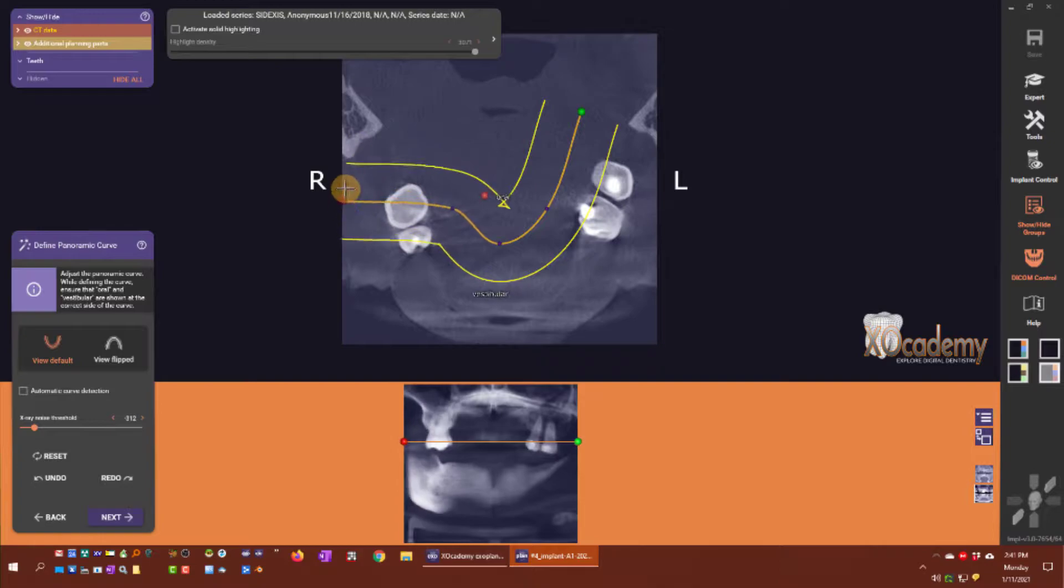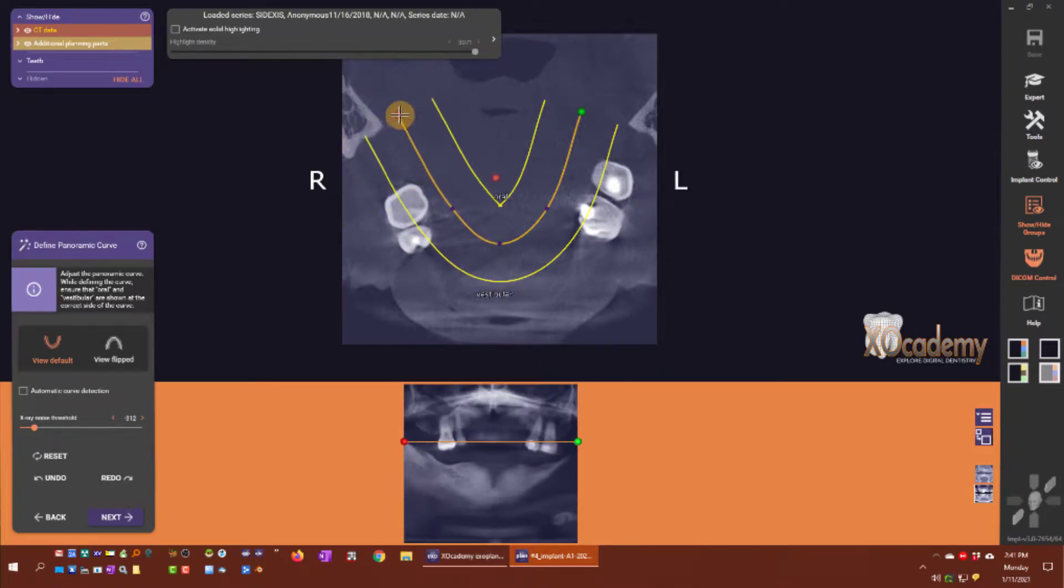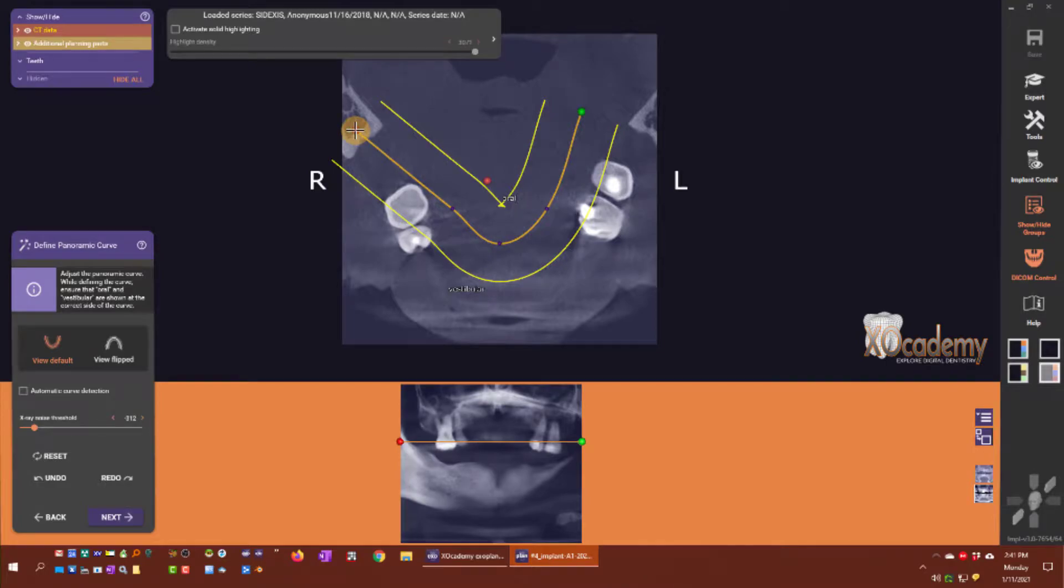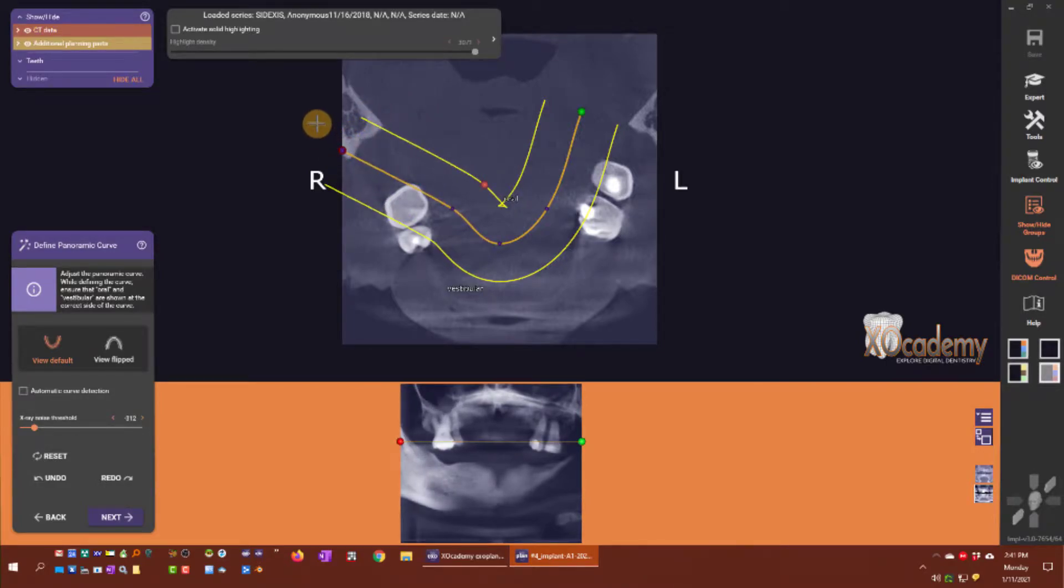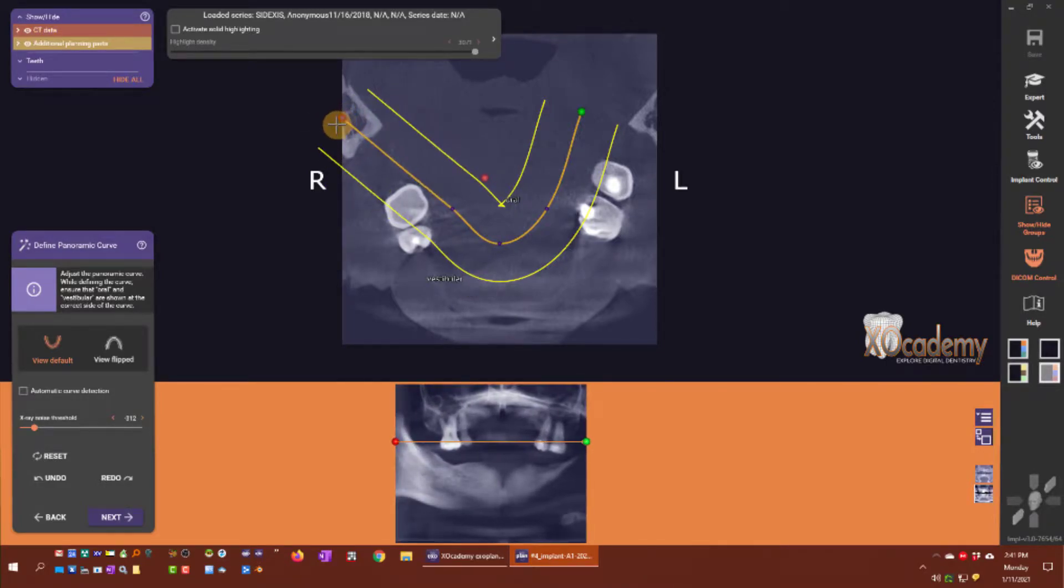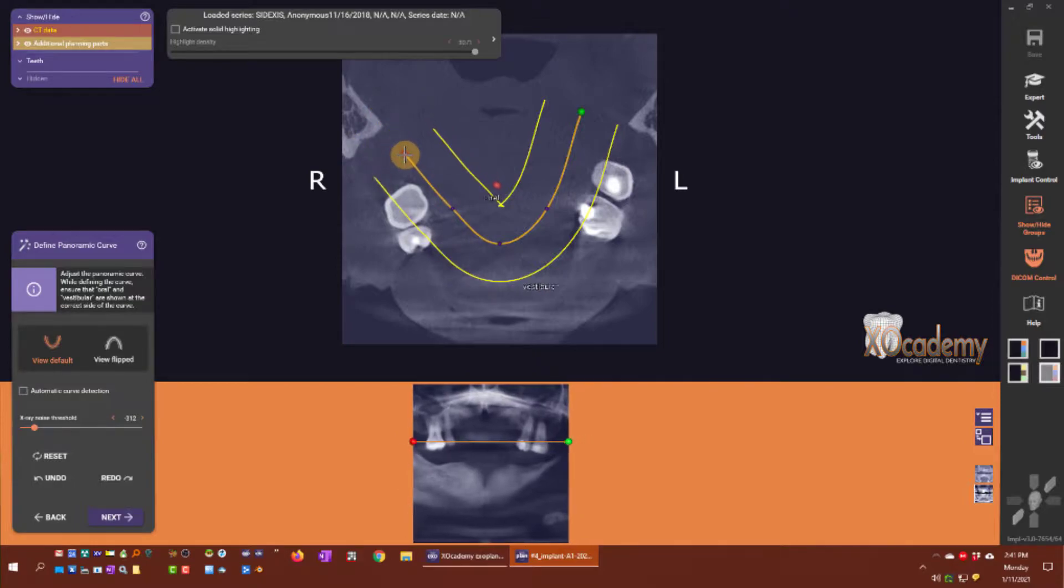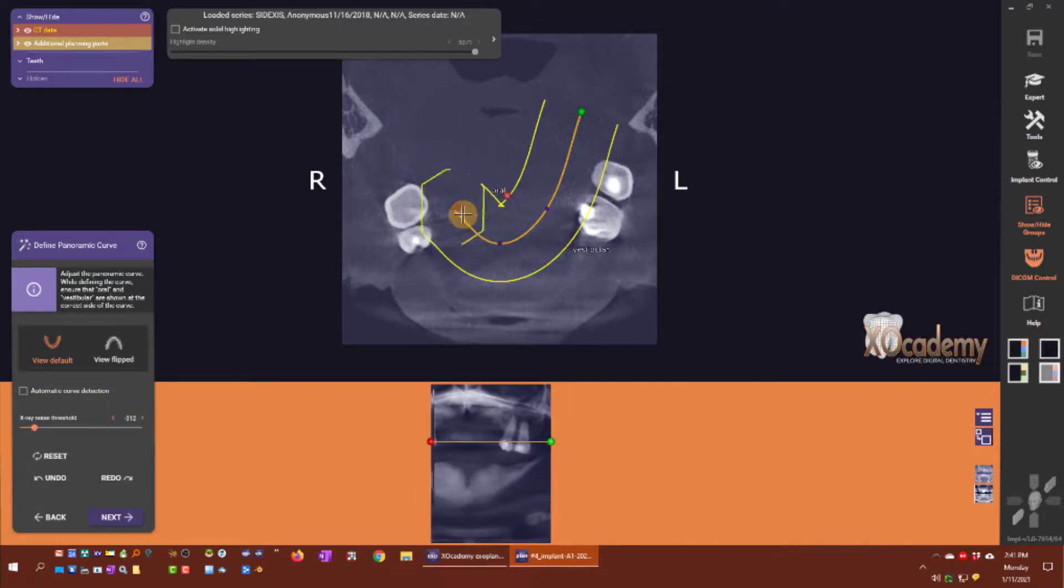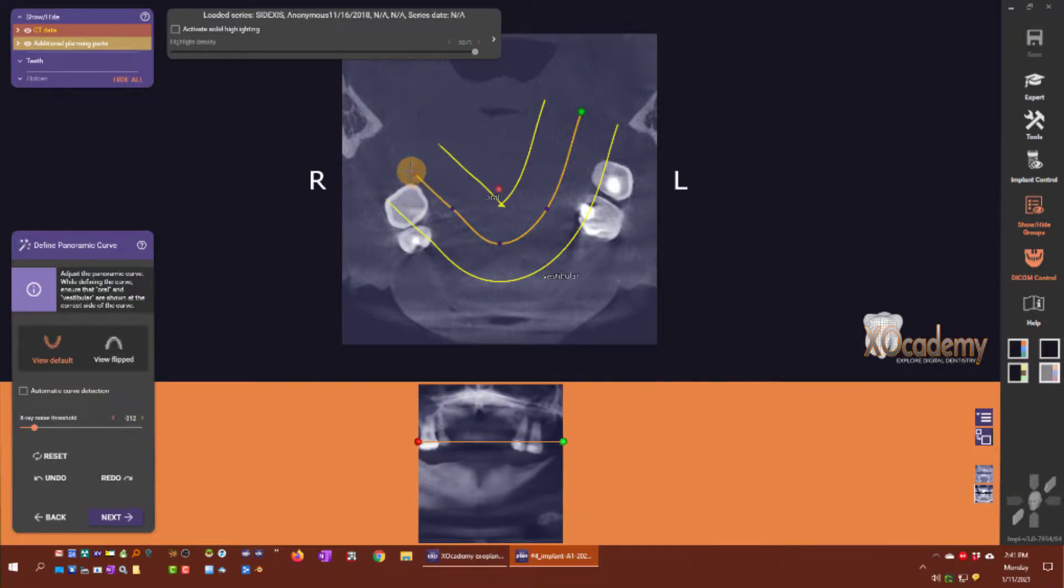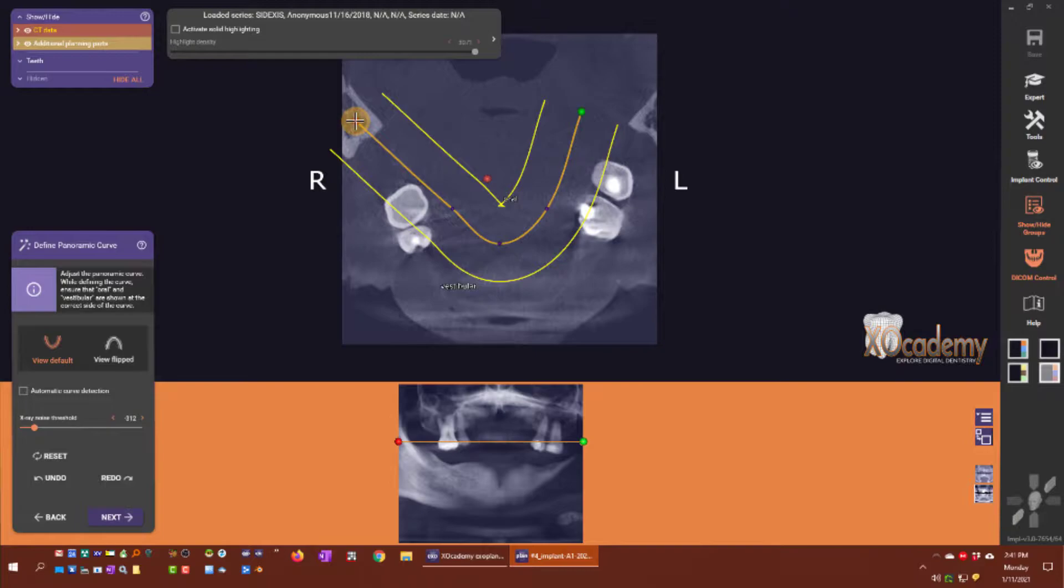If I left click and drag this red control point, that moves the right extent of the panoramic curve, and you can see how that changes in real time with our panoramic composite in the lower window. I'm going to put the distal extent of our panoramic curve on the right here.